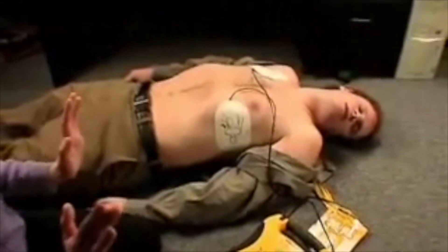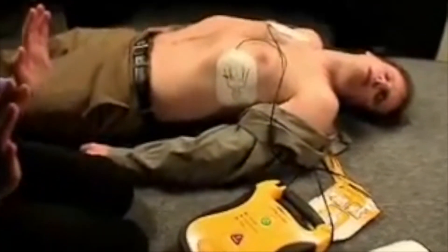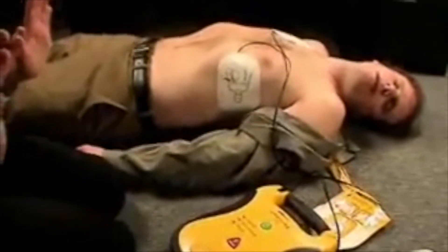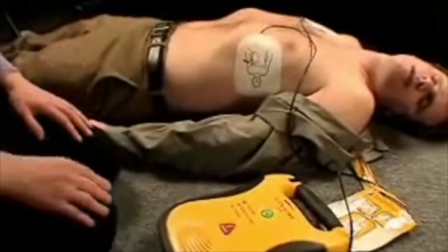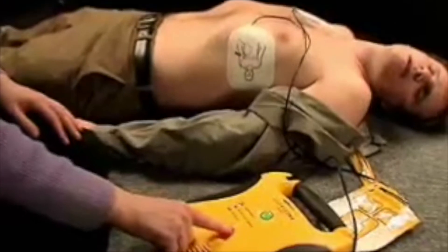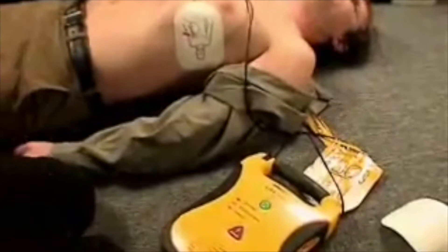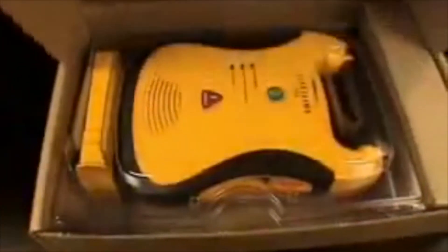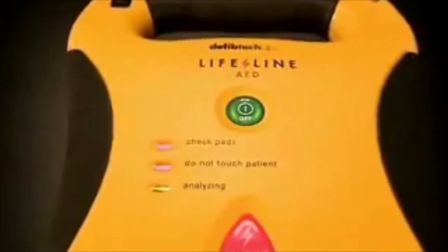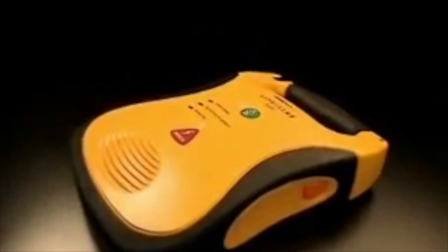Analyzing heart rhythm. Do not touch the patient. The Lifeline AED is designed for the real world. Oversized lit buttons. Preconnected pads stored in the unit. Rubberized surfaces for a sure grip.